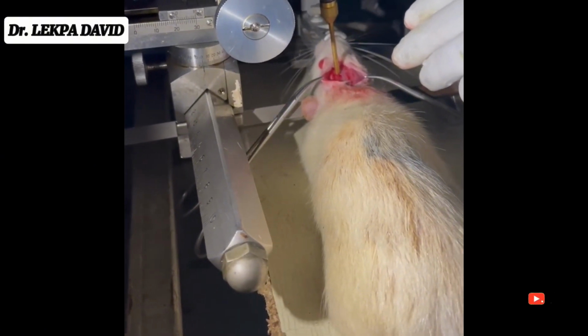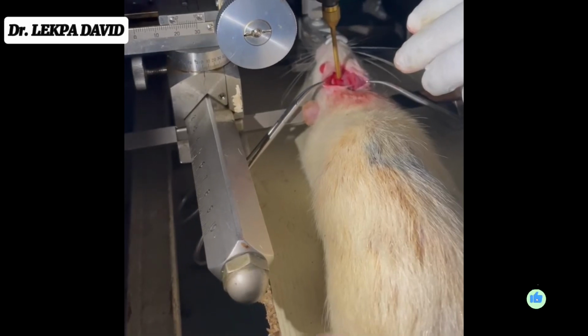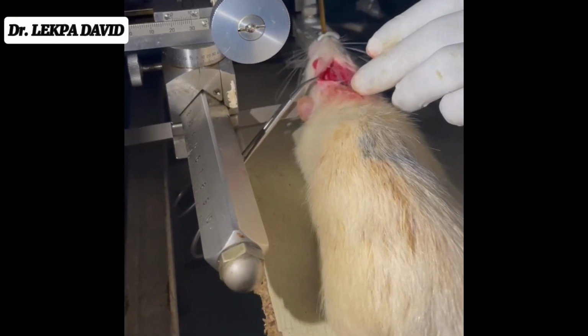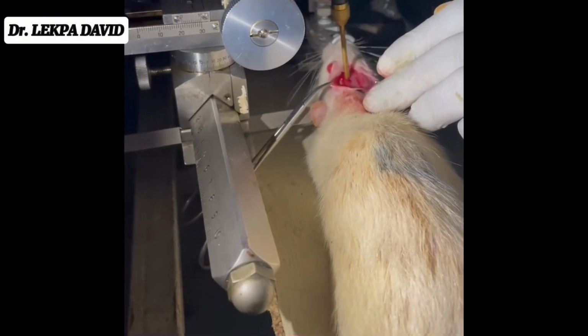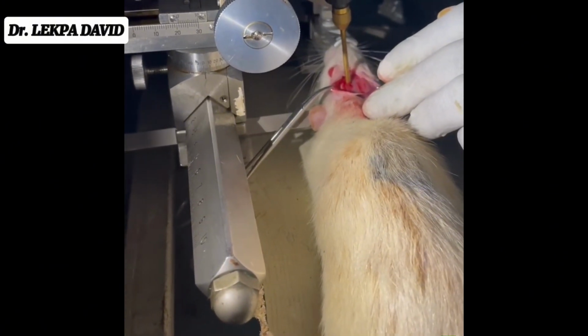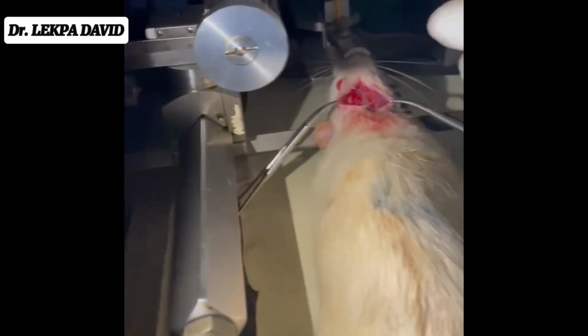It's a micro drill which is used for wood and iron. So I'm being very careful here not to make a mistake so the drill doesn't cause an injury to the brain of the rat, which would cause death.